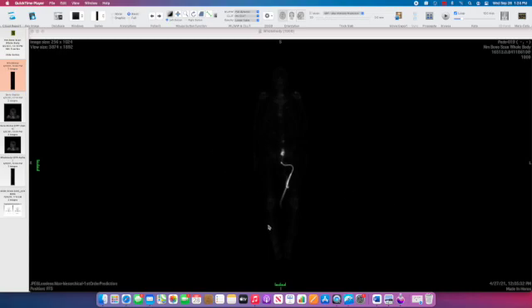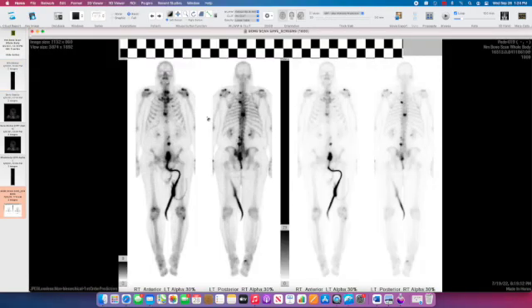When you open a bone scan on this software it will open with a single image and the contrast and windowing is such that you can't really see too much. I'd recommend finding the save screens or the screen summary pages — you can look for the white background to find those — and that will typically give you a view of the anterior and posterior whole body images at two different window settings.